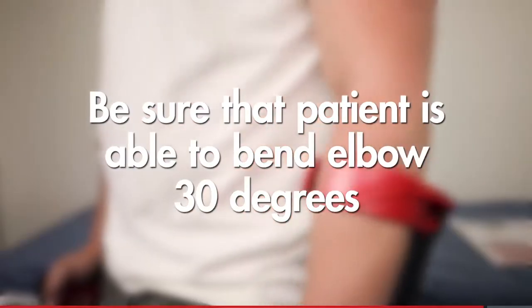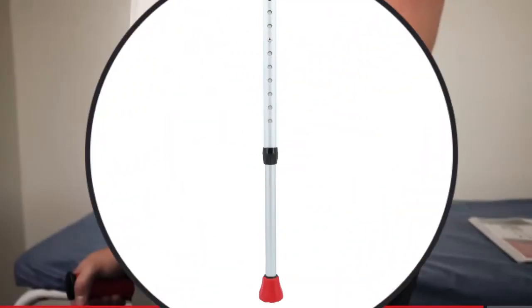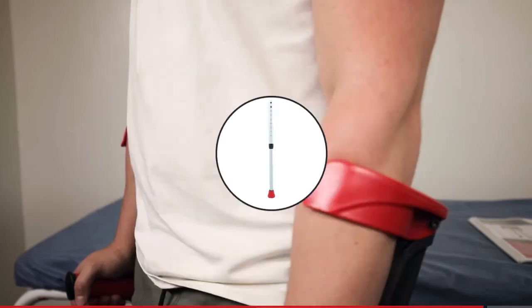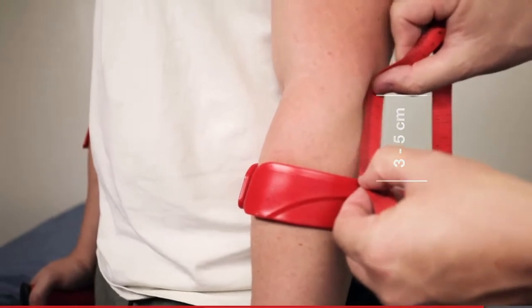If you need to adjust the height, loosen the collar underneath the adjustment holes and push the buttons, then lengthen or shorten the crutches as needed. The cuffs should be adjusted to sit three to five centimeters below the bend of the patient's elbow.